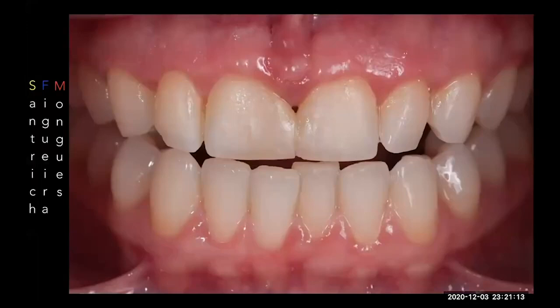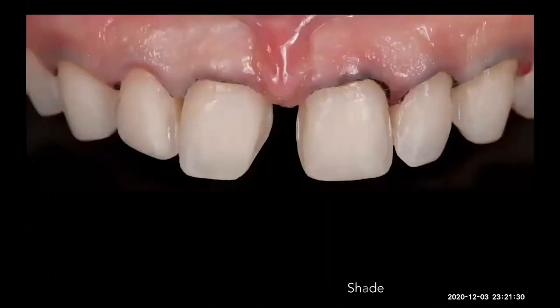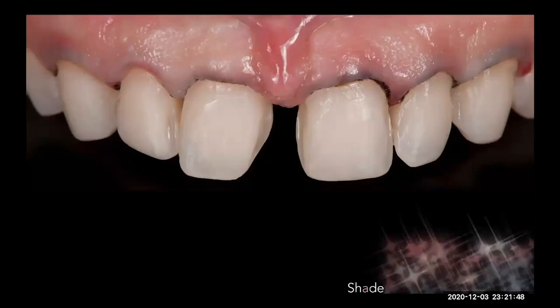This is another case that we did with some friends in Venezuela, where we had a big composite between the teeth, and then they removed the composite, and we found out the big space between the centrals. And he did a nice preparation going back, maybe at the same level, a little bit back from the papilla, because it is the only way to cover the connection between restoration and teeth. So he did a great job.